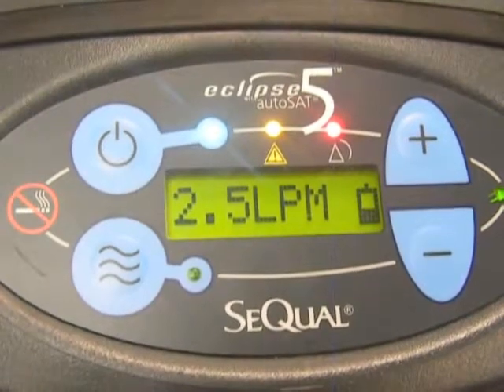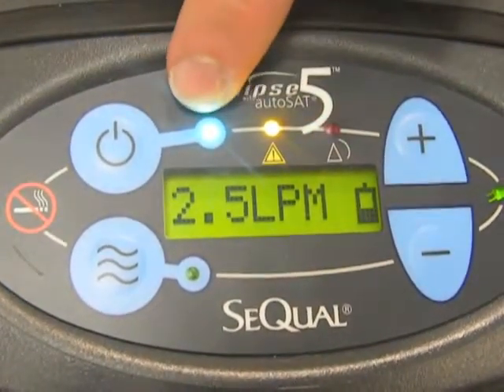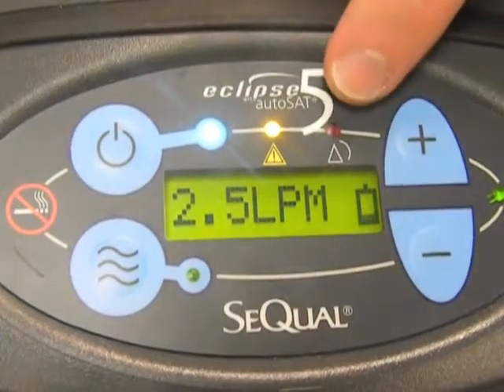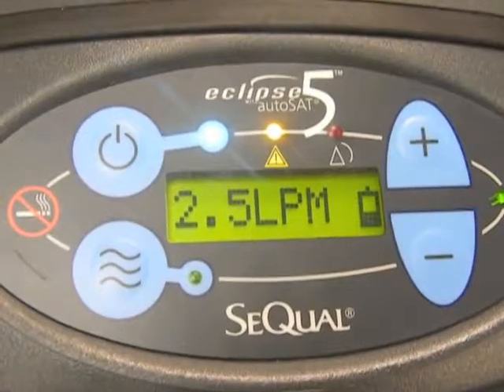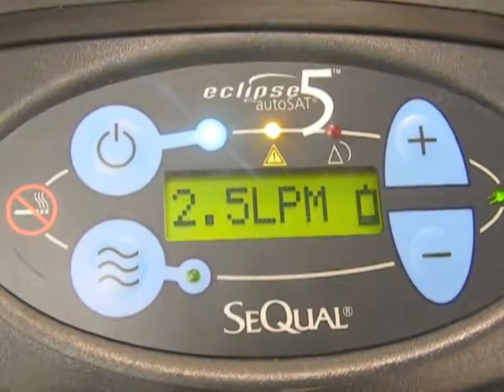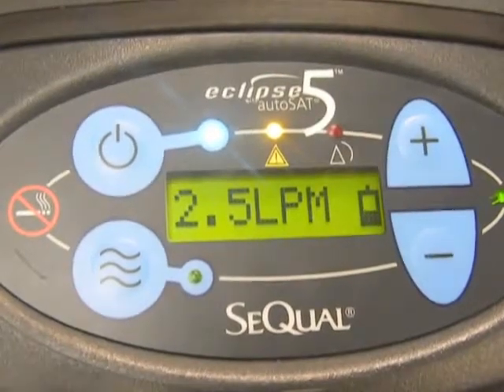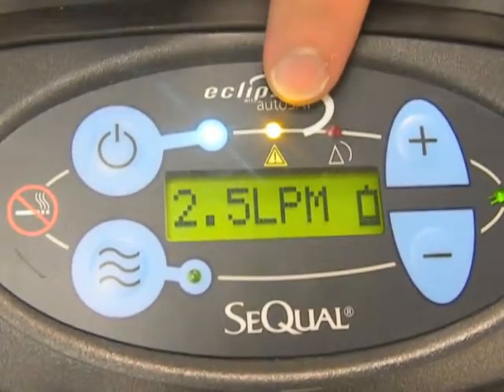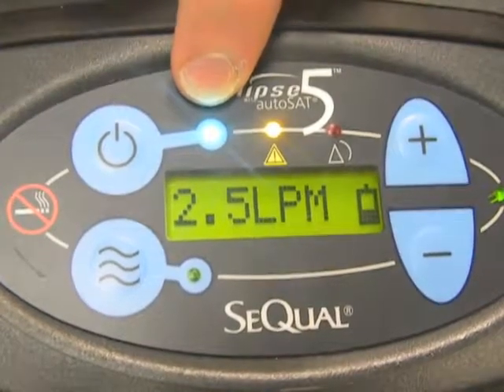When you do this, the machine will turn on and beep, and all three lights on the front display panel will light up. As you'll see, gradually, the red light and the yellow light will go off. This is part of the normal warm-up period of the device. It is normal to see all three lights in the beginning. It can take up to 5 minutes for the red and yellow to go off, and then only the green will remain. This indicates the unit is running properly.